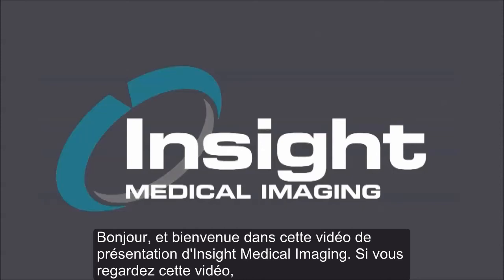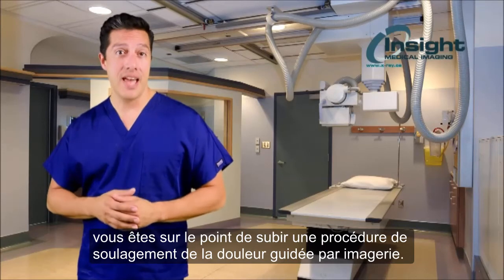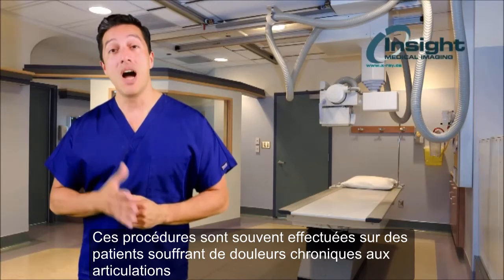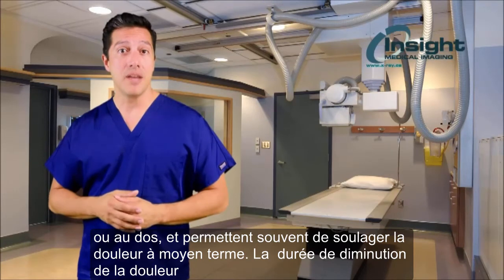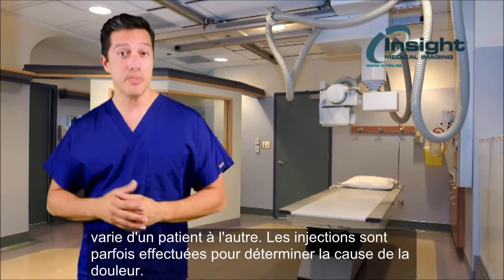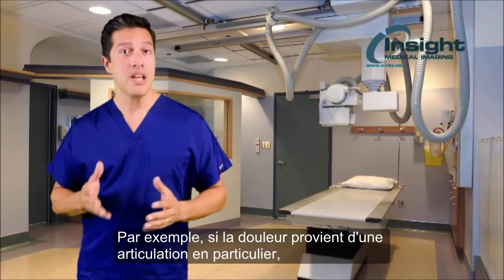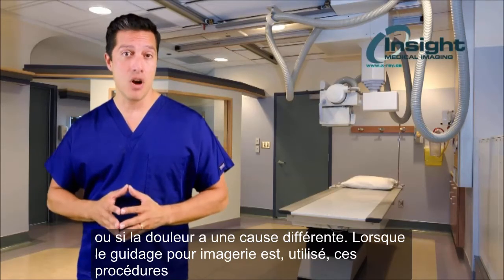Hello and welcome to Insight Medical Imaging. If you're watching this video, you're waiting to have an imaging-guided pain management injection procedure performed. These procedures are often performed on patients with chronic joint or back pain and can often provide medium-term pain relief. The duration of relief varies from patient to patient. Injections are also sometimes performed to help determine the cause of pain — for example, if the pain is coming from a specific joint or if the pain has a different cause.